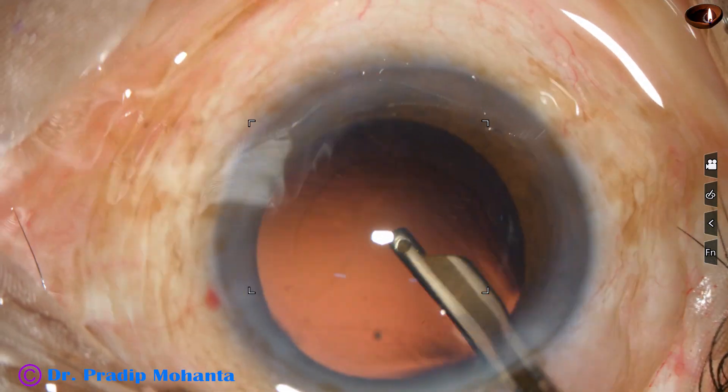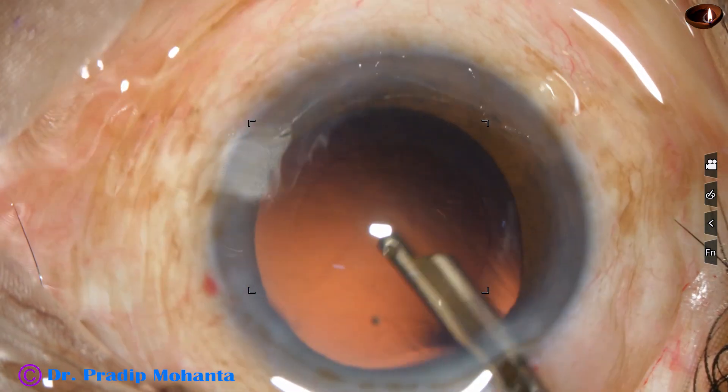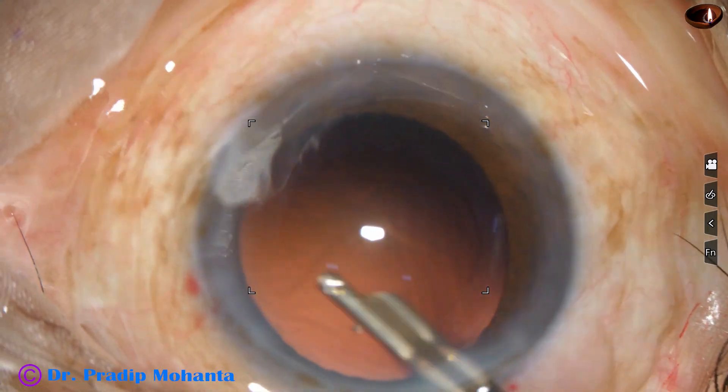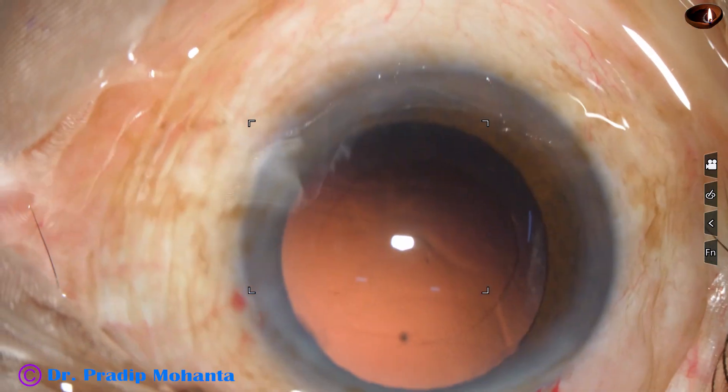And it is done. See — these wounds are not stretched, there is no fish-mouthing. As soon as I remove the instrument, the lips of the wounds are closed.